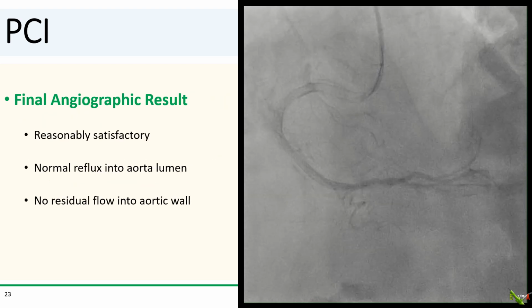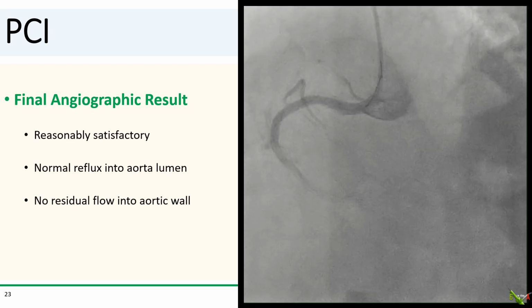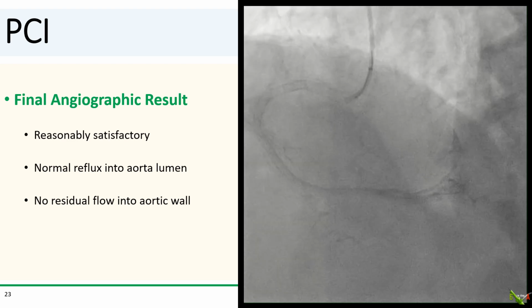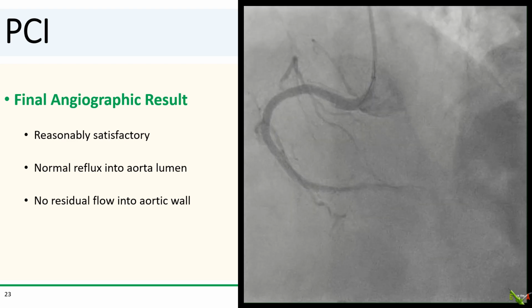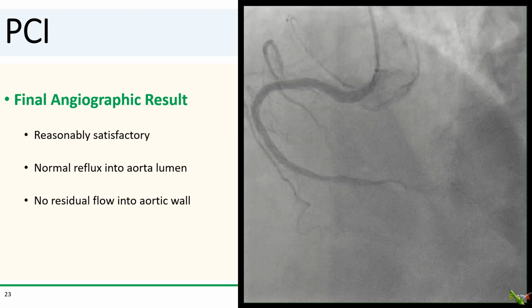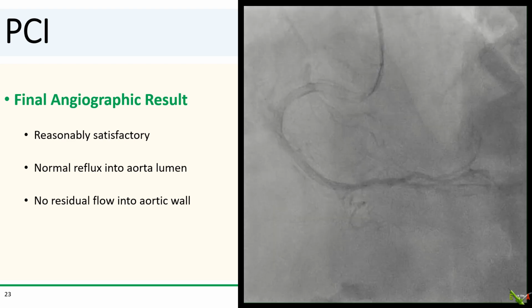So here is the final angiographic result, which we thought was reasonably satisfactory. There was normal reflux into the lumen of the aorta, and there was no residual flow into the wall of the aorta. We also did an injection of the left coronary artery, which thankfully remained unchanged.